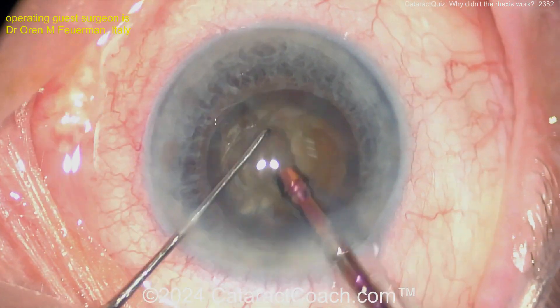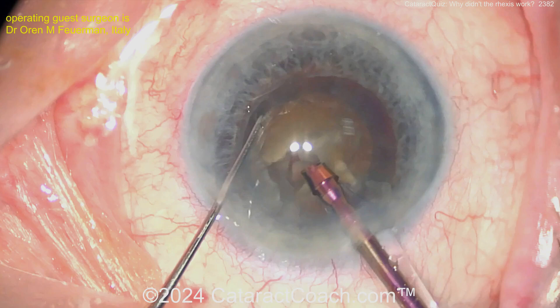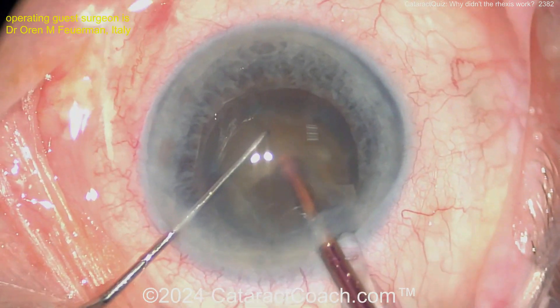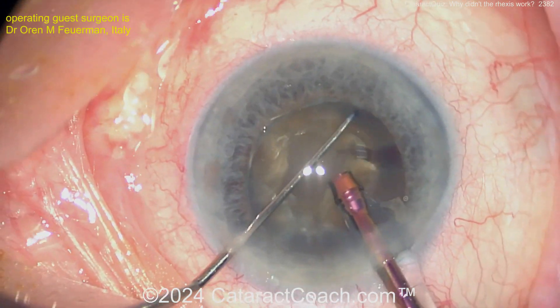The rest of the case should be pretty normal. So that's our cataract quiz for the day — what was that? It's a split anterior lens capsule, meaning it's like a doubled-up lens capsule. The entire width of the anterior lens capsule was doubled. Interesting — so different.